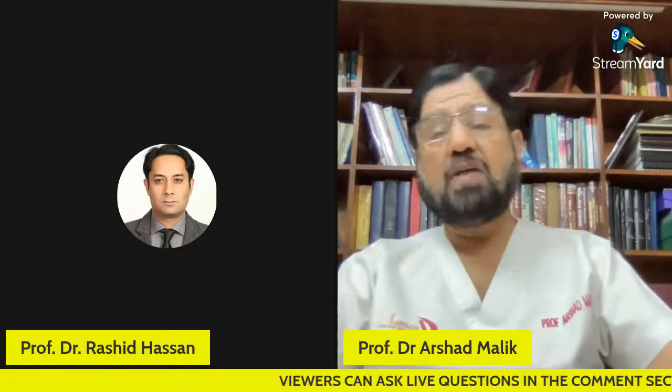Now we have different wavelengths, and these wavelengths have different parameters. Starting from the smaller parameters and going up to the higher parameters, as we raise the wavelength, the energy is raised, its effect is raised, its absorption is raised. In the initial stages, all those lasers of lower parameters are used for photobioactivation, that means to get a biological effect. Then as we move above, we get other applications related to heat generation: cutting, vaporization, or debulking of the tissue.